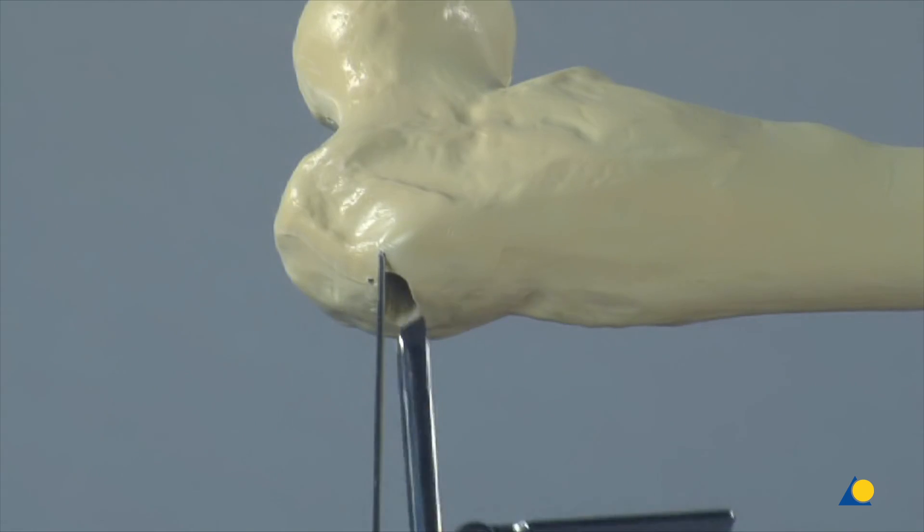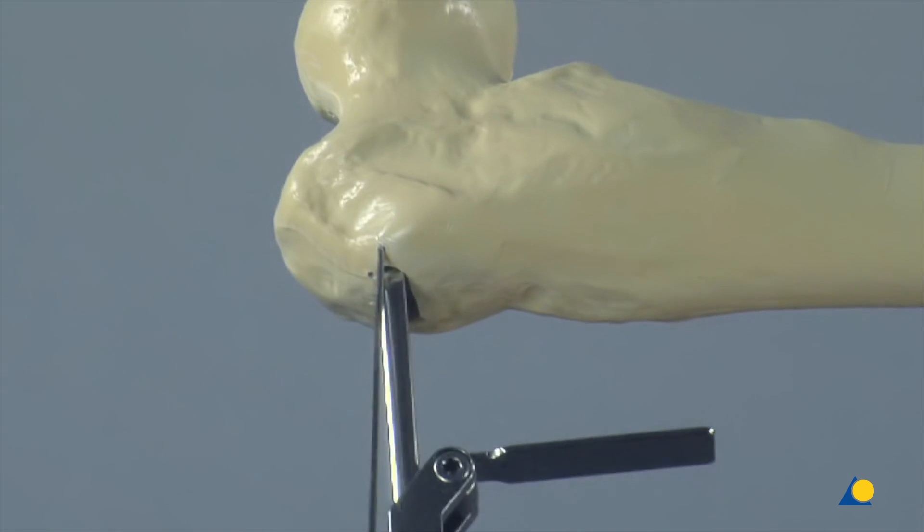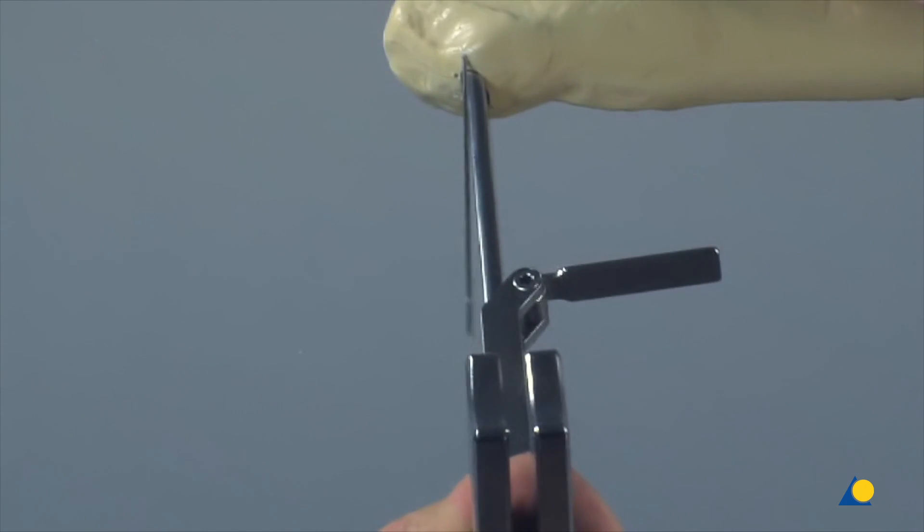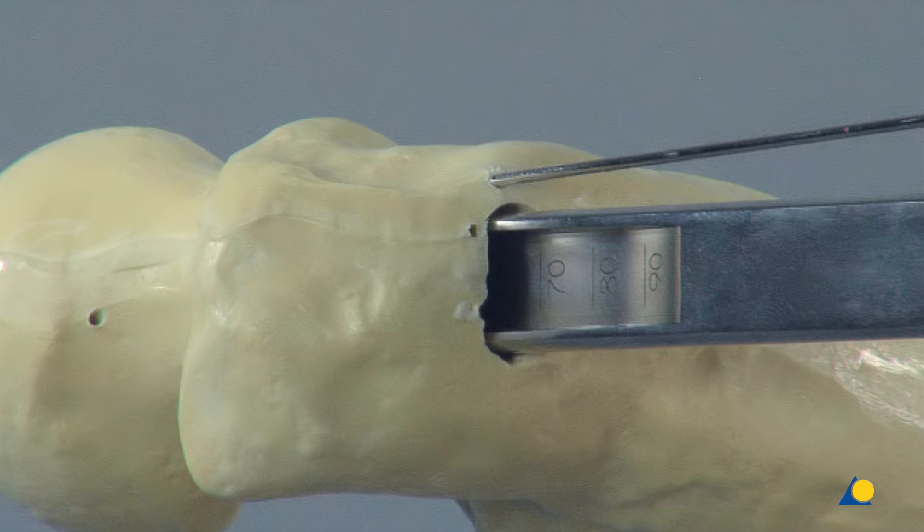The seating chisel is inserted to a depth of 60 millimetres with a hammer. The slotted hammer is used to control the rotation of the seating chisel.